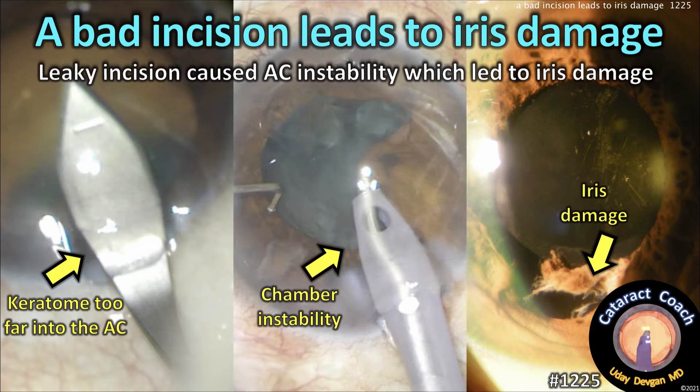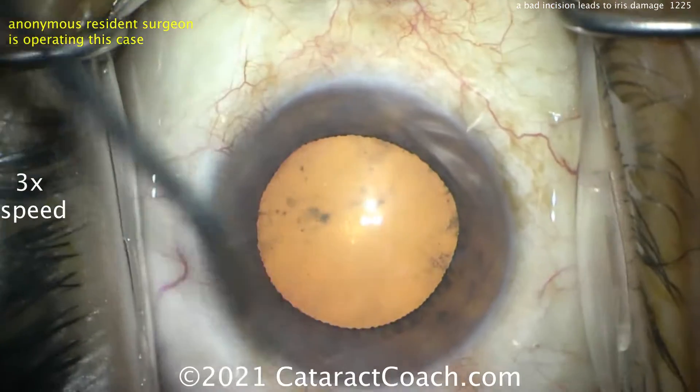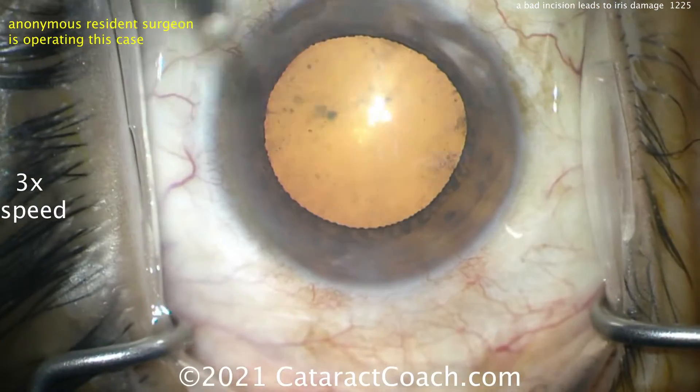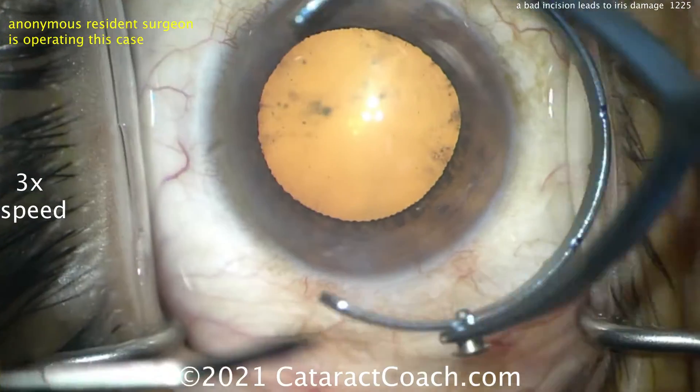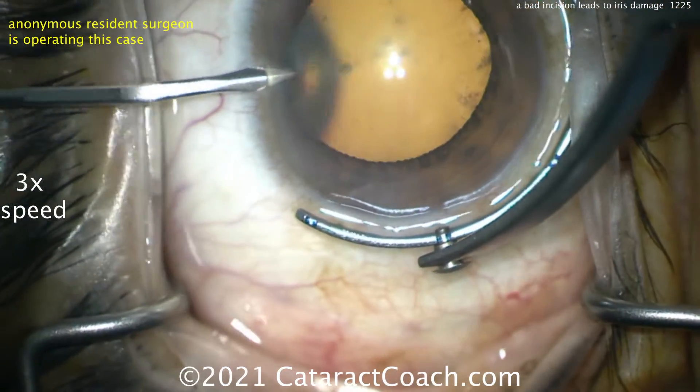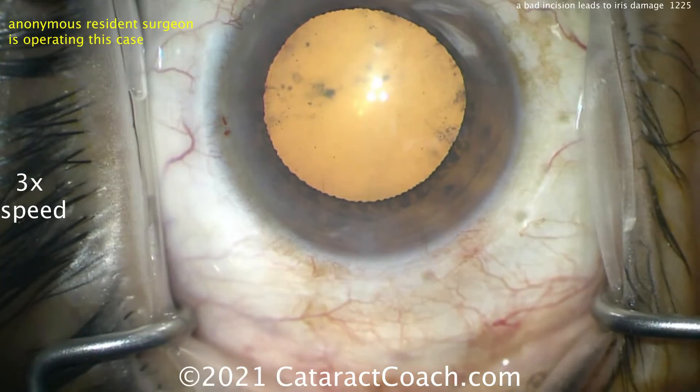cataractcoach.com. A bad incision leads to iris damage. An extra wide incision is too leaky and that gives you anterior chamber instability. We've got a resident who's operating here — we're going to keep him anonymous. This is three times normal speed; we'll slow down the video for the main incision. There's the paracentesis, which looks good.